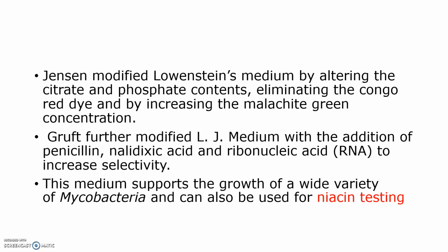Gruft, another person, further modified LJ medium with the addition of penicillin, nalidixic acid and ribonucleic acid to increase selectivity. This medium supports the growth of a wide variety of mycobacteria, and can also be used for niacin testing.